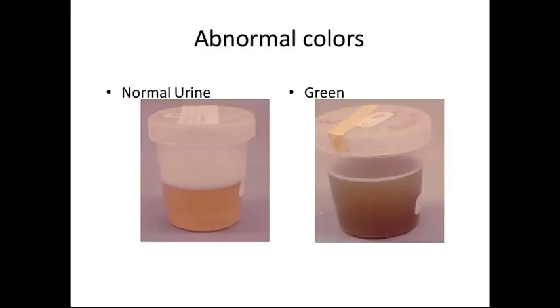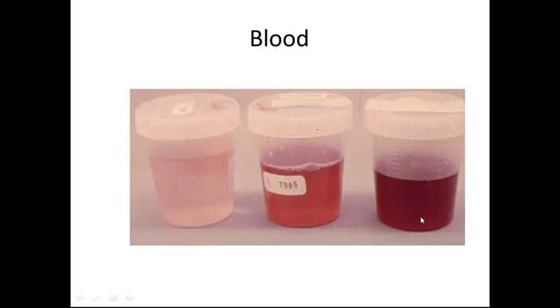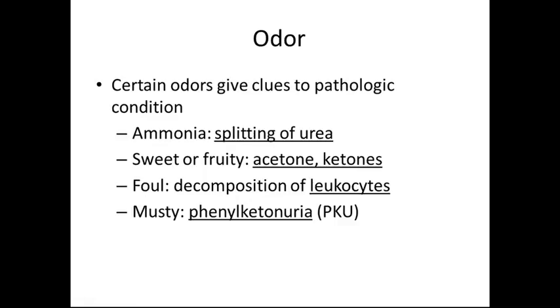Examples of abnormal colors: on the left-hand side we have what normal urine looks like — the container is labeled on the lid and on the cup portion. Here is an example of green colored urine, with a little bit of foam on top of the specimen. Additional examples include pink, clear-red, and dark-red or reddish-brown colored urine.